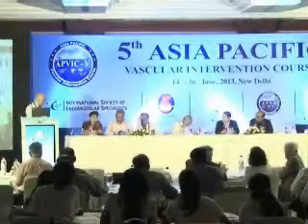But I think a venous Doppler is one Doppler study which really needs patience. In arterial, you can finish the study in 15-20 minutes, but a diseased venous Doppler will take a lot of time, and a lot of patience is required once you're examining the system. You can really give a lot of good information if you do a good Doppler. The people who do the laser therapy really need information on perforators, because if they miss out the perforators, they don't treat them, and the recurrence happens. So a lot of coordination is required between the person doing the Doppler and the intervention.